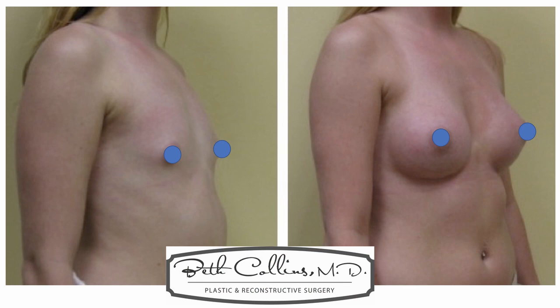The next subject is where we put the implant, whether we go over or under the muscle. And there are vast amounts of opinions about this. If you ask 100 plastic surgeons, 50% of them will say one thing and the other 50% will say the other thing. What I could say is it really does depend upon the patient. There are certain patients who are absolutely not great candidates for going over the muscle because they don't have any breast tissue at all to hide the edge of the implant. And then some people who really need to be above the muscle because their breasts have a little bit of ptosis or sag to them, so that they need that implant above the muscle to fill in that loose tissue envelope.